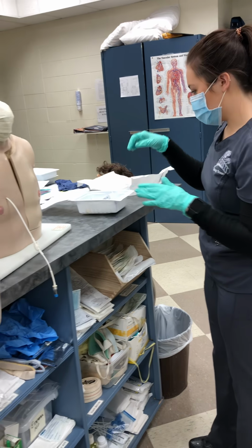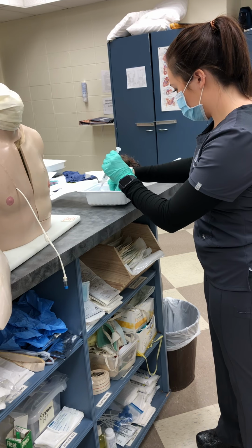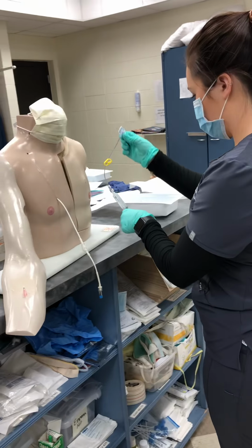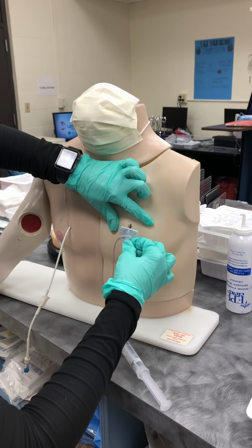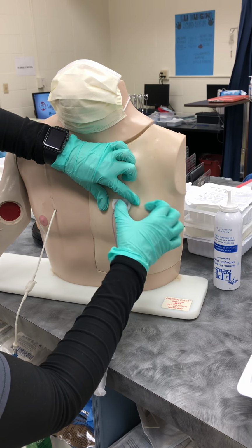And now after that's dry, we're going to grab our needle. I'm going to hold the skin, and we're going to insert the needle.